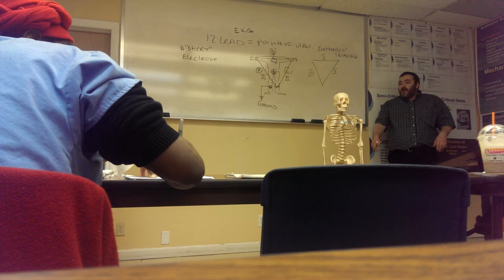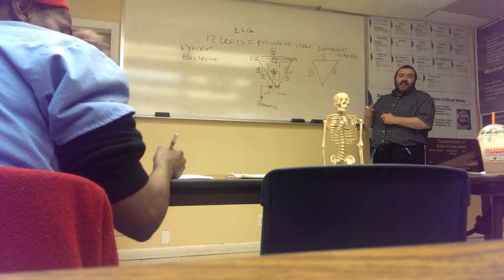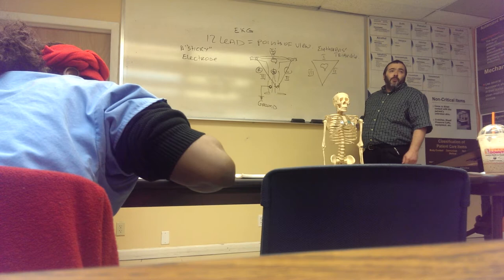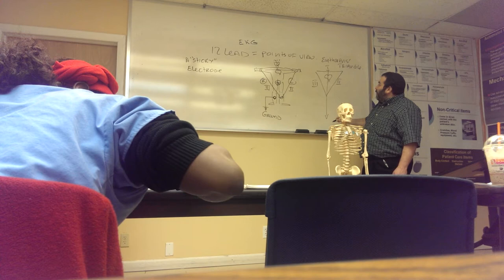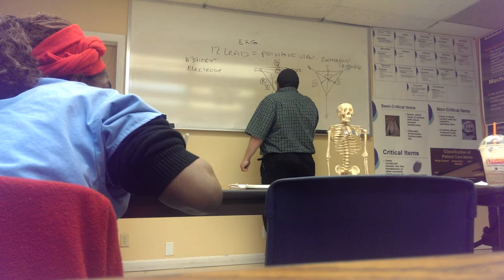But it wasn't enough. Dr. Einthoven said, you know what, I'm a scientist. I want to get a few more views out of this triangle. So he said, I'd like to be able to look, and the heart is in the middle here somewhere. I'd like to get another few points of view, and I'm going to put my pair of eyes over here and look down. I'm going to take my pair of eyes in this side of the triangle and look this way. And I'm going to do the same thing over here. Okay, so, bang, bang, bang.